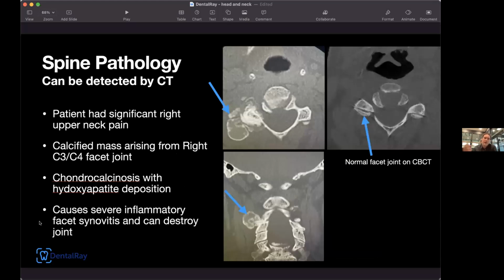As we've referenced, and I think we've referenced, other uses of cone beam CT, including chiropractors would certainly be in this realm where we're focused a little bit more on the spine. But this is also an area that I'm showing you over here on the right side of the screen. This is from a cone beam CT that shows you, again, excellent detailed anatomy of this bone.